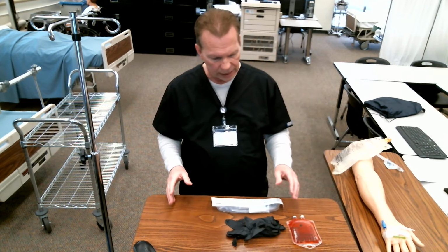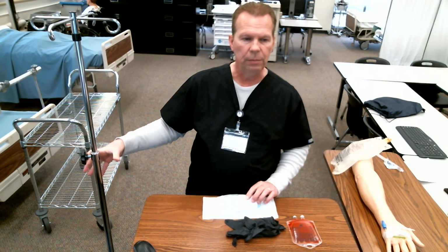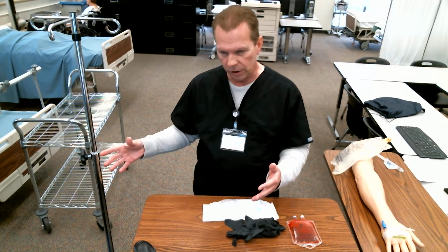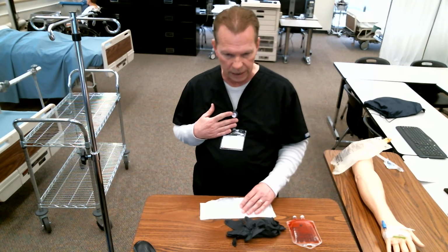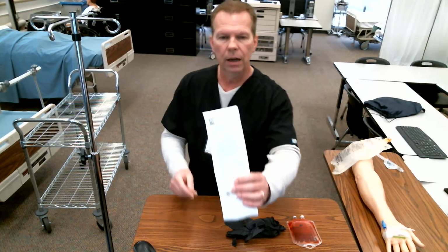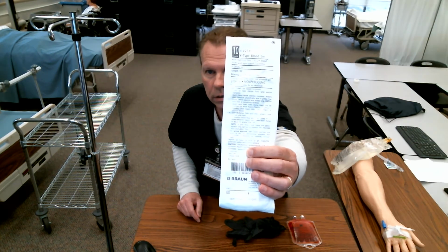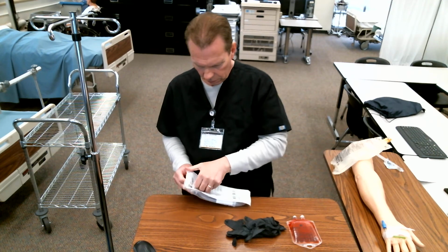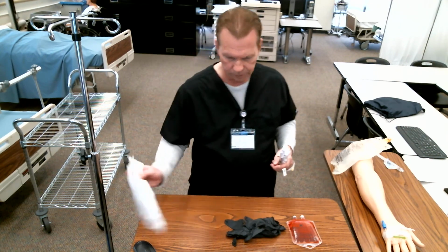Okay, so what I need to have for my supplies is an IV pole with a pump. I'm not going to demonstrate the pump because this video is going to be too long. Read the directions on your pump. Every pump is different. If you'll just read the directions, the pumps are self-explanatory. That's what I've found. But anyway, having said that, you will need what we call a blood Y tubing. I think you can see it there a little bit. Okay, blood Y tubing set. And of course you need your blood product.